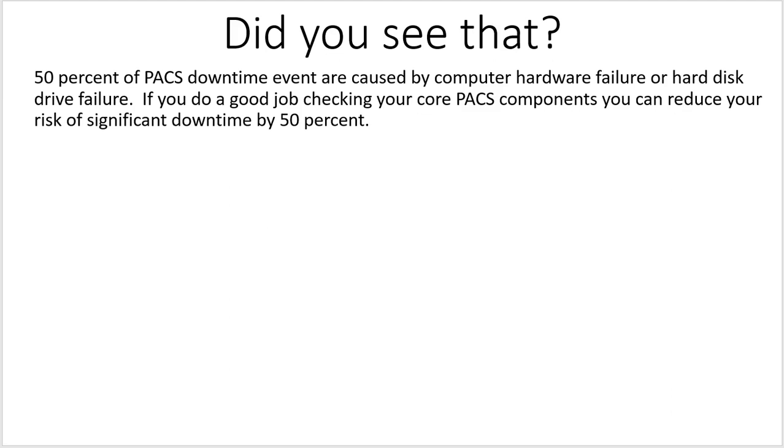50%. Did you see that? 50% of PACS downtime events are caused by computer failure or hard disk drive failure. If you do a good job checking your core PACS components, you can reduce the risk of significant downtime by 50%. Always be checking the core of your system.